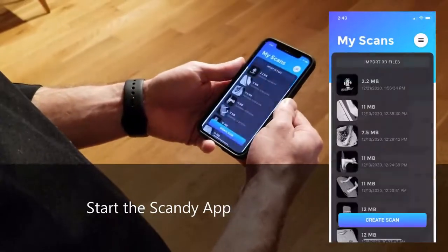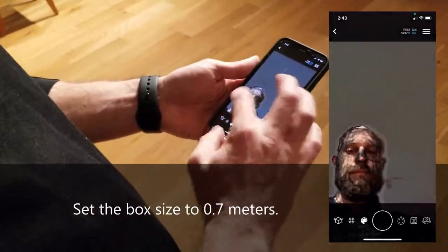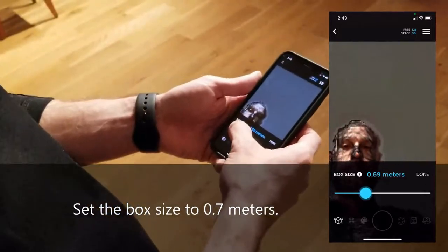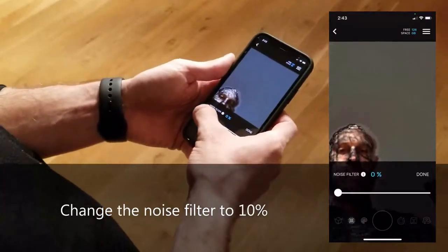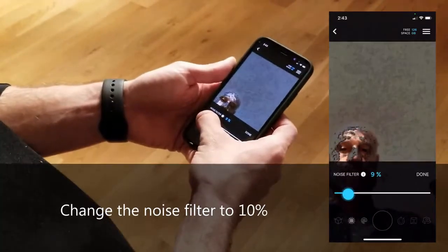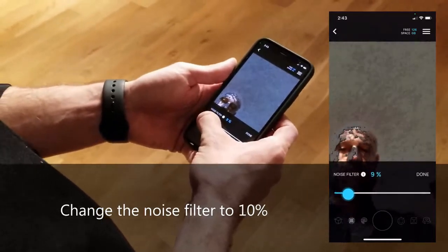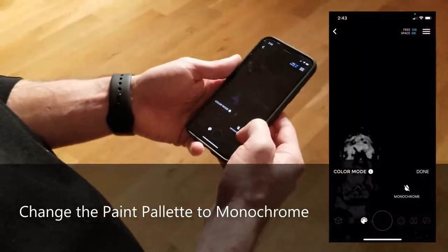Start the Scandi app on your Apple device and press Create Scan. Click on the cube on the bottom left and change your bounding box to 0.7 meters — you can adjust this if the feet are larger or smaller. Click on the dotted sphere and change your noise filter to 10%. If you have more natural light coming in, you can increase this to 15 or 20%. If you have less natural light, you can decrease it to 5%. Click Done. Then click on the paint palette and select Monochrome. Click Done.